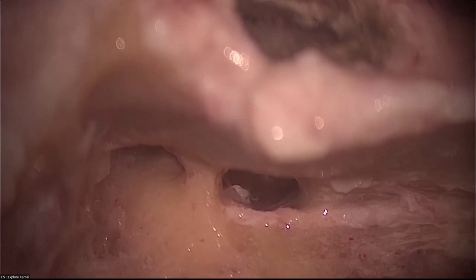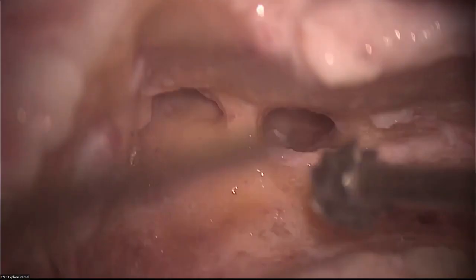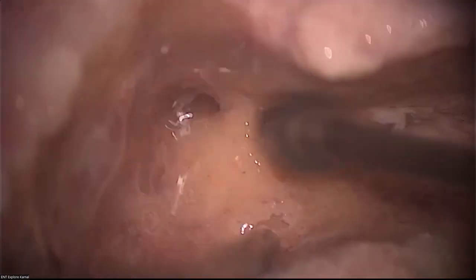In all those difficult anatomy and narrow recess cases, you can simply make a cut over here and a cut over here, just the bony cut, keeping the tympanomeatal flap intact, and push it anteriorly. We can replace it later and put some bone dust, without any problem.